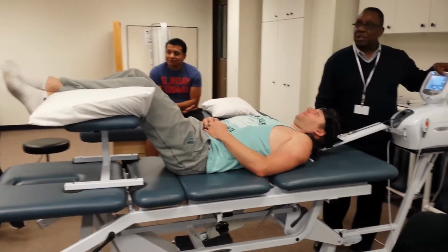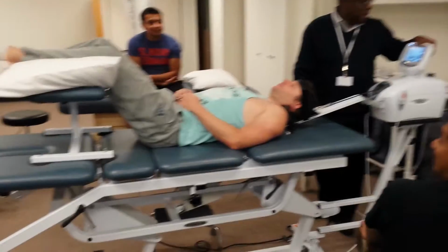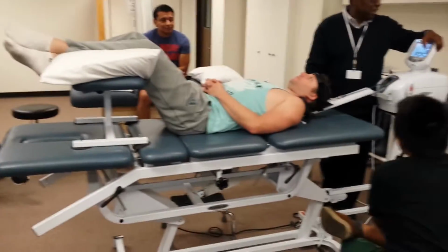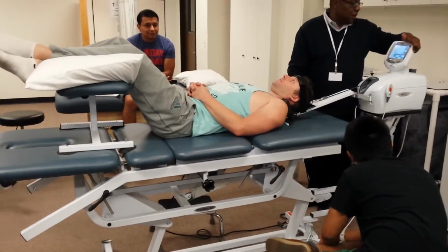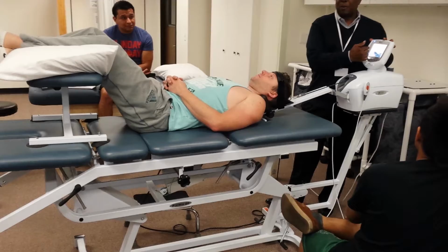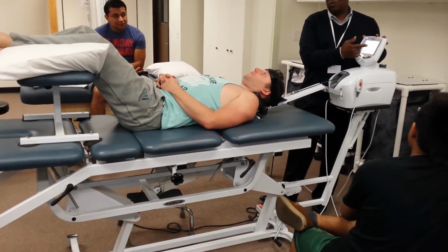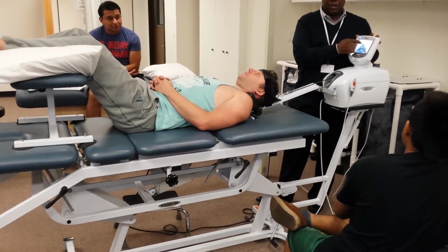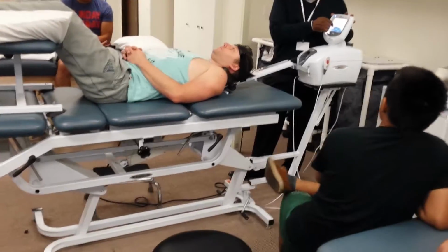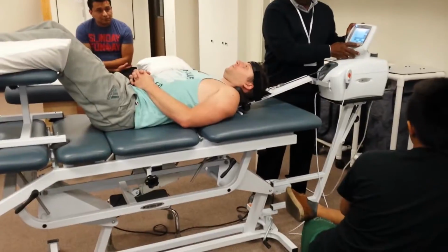All right, so I'm going to tell you what my settings are. My settings are max 12, min 5, hold time is 10, rest time is 5. It is going to be intermittent. So this is the pattern. This thing will show you the pattern of it, which is kind of cool. It'll show you how it's going to stair step, then it's going to hold, drop back down and rest completely, then come back up.